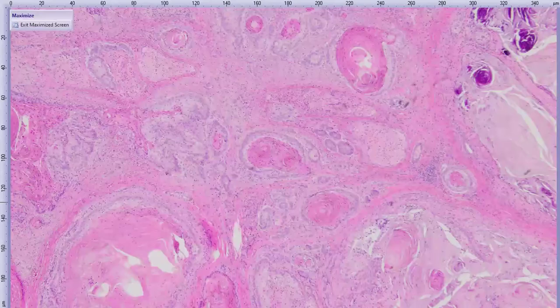So I definitely put in the comment about how I would suspect this horse may be one with a mutation, and that might explain why this horse got squamous cell carcinoma in both eyes. In terms of solar-induced mutations, animals with lightly pigmented skin around the eyes, and some exposed areas, are more prone.